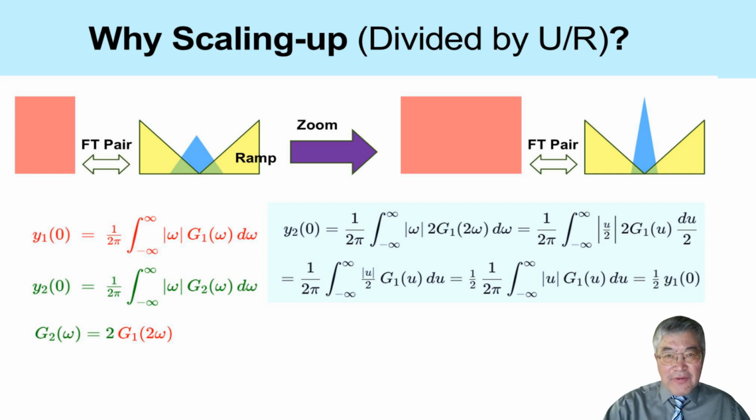Once the ramp filter is included, the scaling factor appears in the denominator of the reconstruction formula. This gives us the missing factor needed to explain the squared weighting term in the fan beam formula. So the lesson is simple. We cannot analyze the projection magnification alone. We must analyze the magnification together with the ramp filtering step.